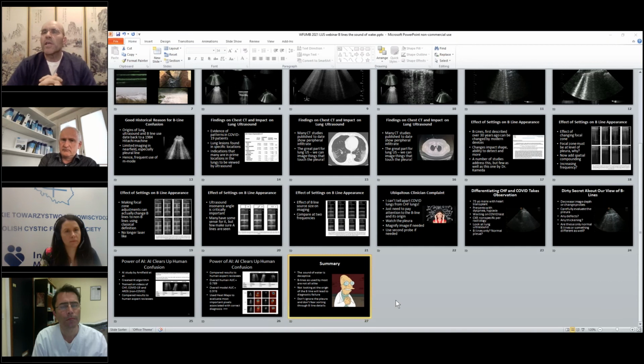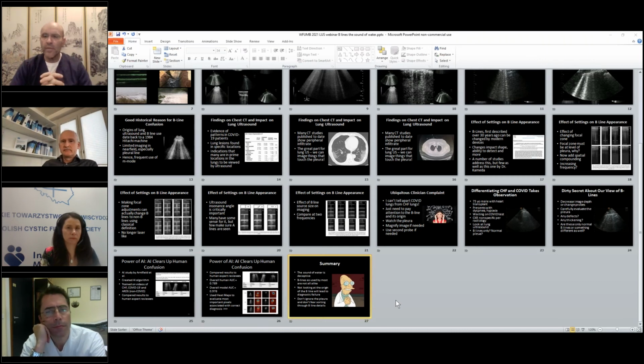But the one place you can catch all of those over time is the emergency department, because I'll have patients that are chronic, that have deteriorated and are coming in arrest, and I have to intubate them. That correlates to certain findings. I have patients that are mild and go home. That correlates to certain findings, and in between.